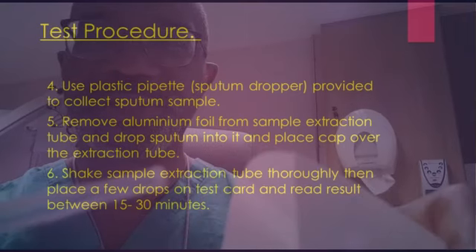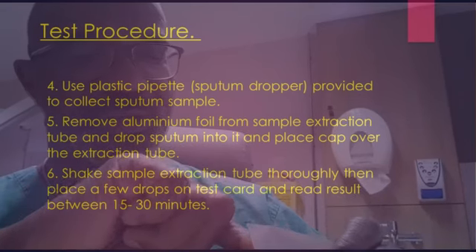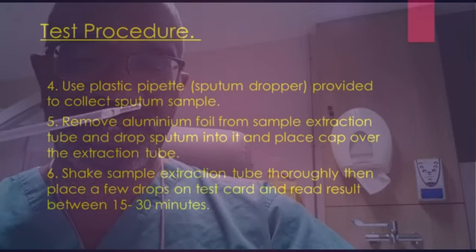I previously rinsed out my mouth before doing that. Then you want to take a sample. Ideally, you want to take a sample from here with the pipette provided. Is this. And you only need very little, about 3. So you squeeze it and then bring it up into your pipette.